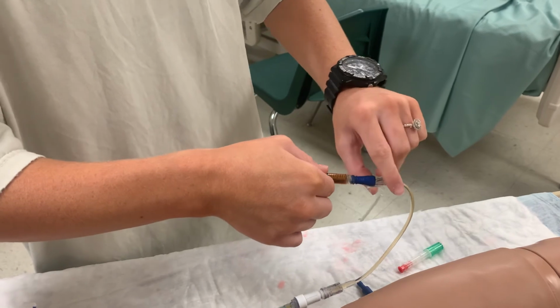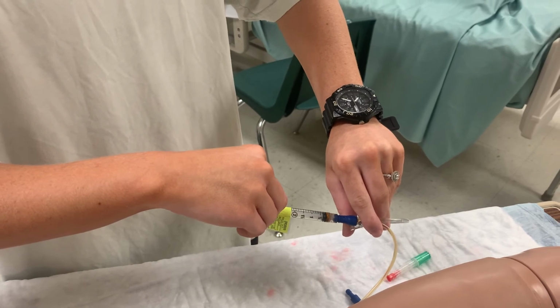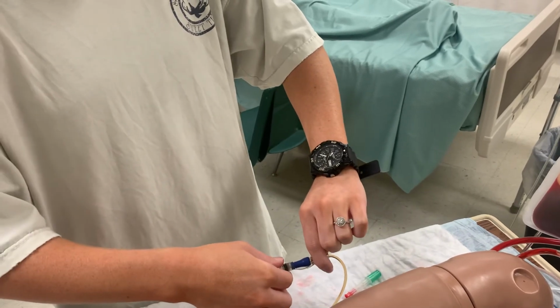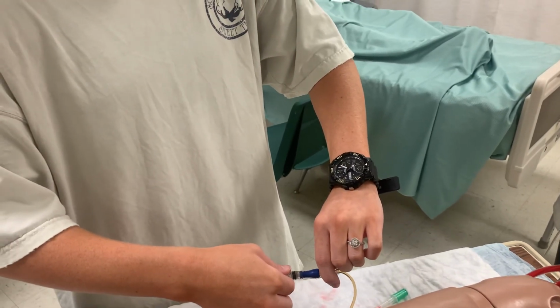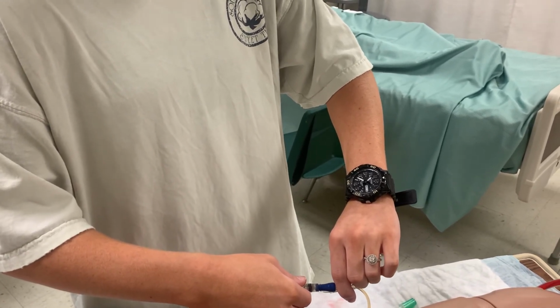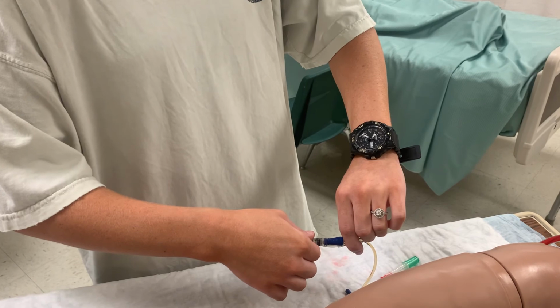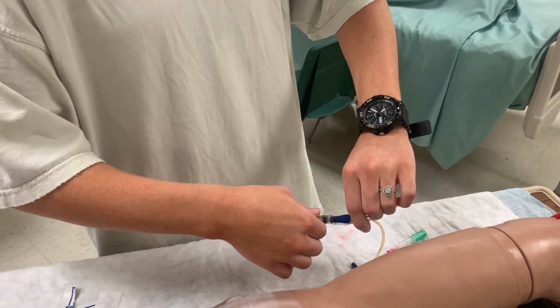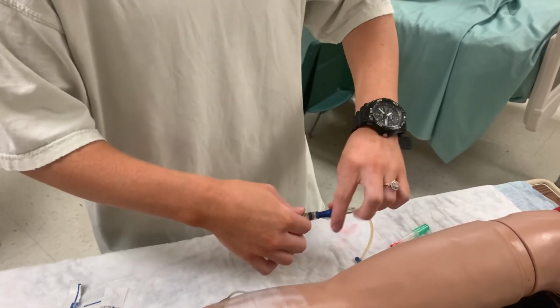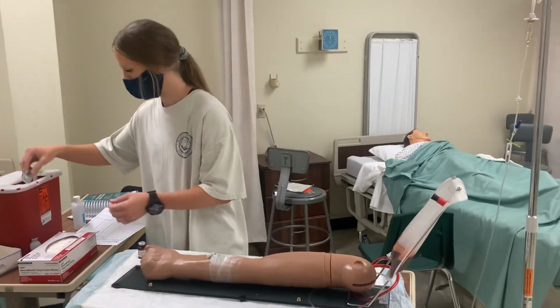Okay, now I'm going to clamp the line again and push the last milliliter, and unclamp for 30 more seconds. Okay, so we have pushed furosemide over 1 minute, so now I'm going to put all this in the sharps.